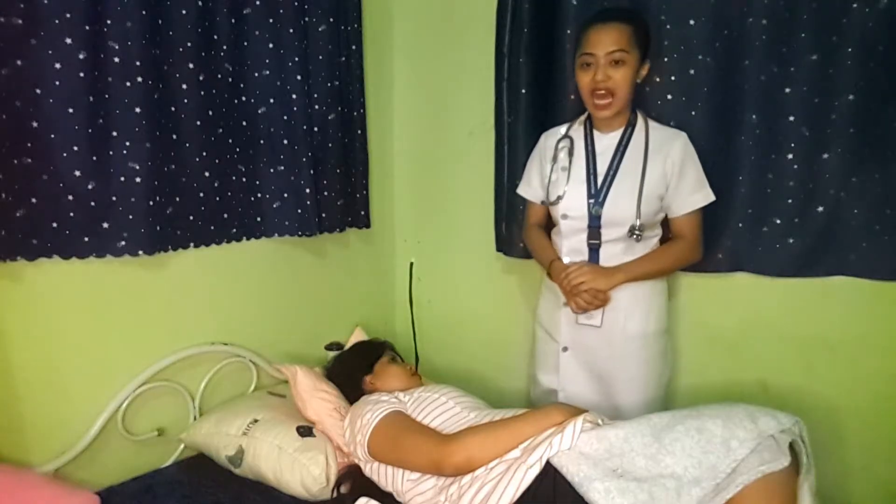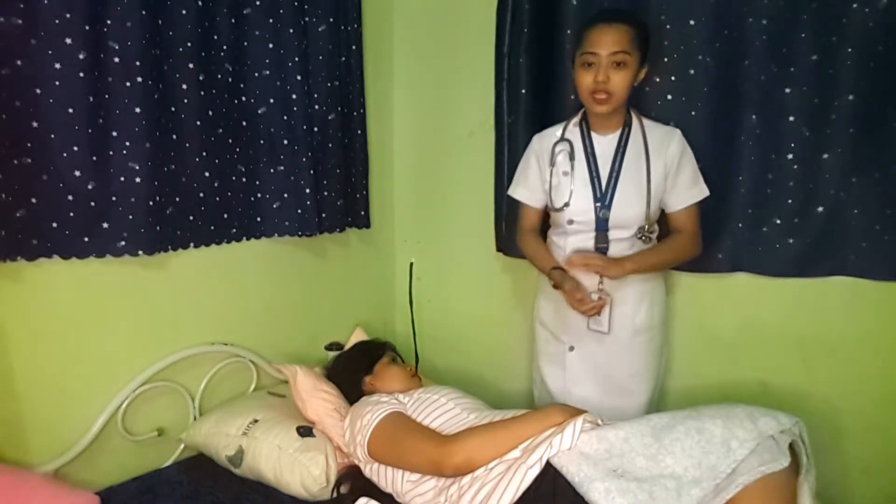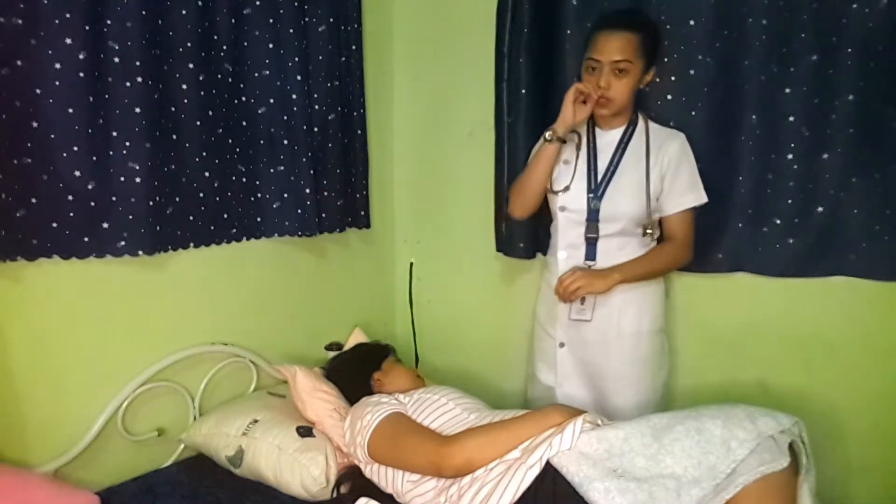Good day, I am Rizekiel Madison-Cantilio, and for today I'm going to perform the fundal height measurement, Leopold's maneuver, and auscultating fetal heart rate. Prior to doing all of the procedures, we need first to identify and explain the plan and procedure to the client.